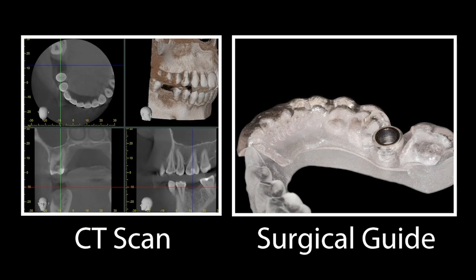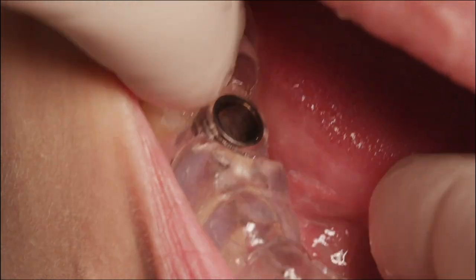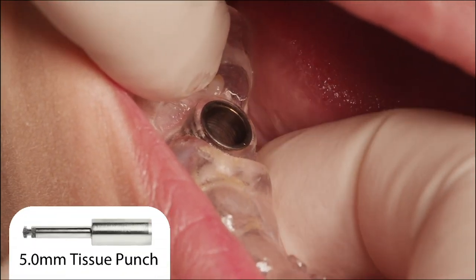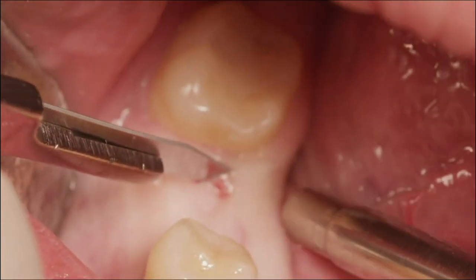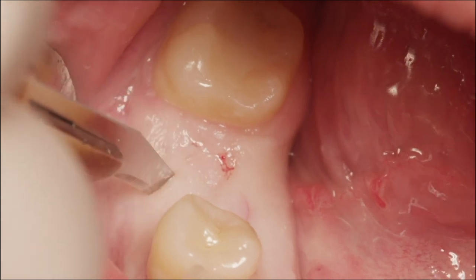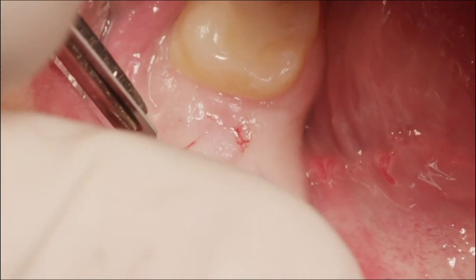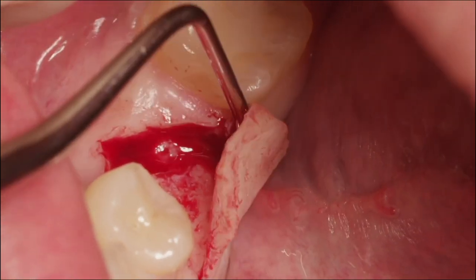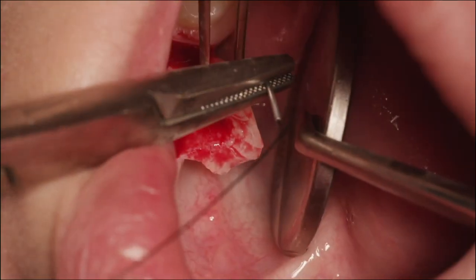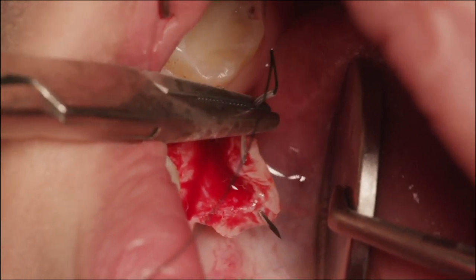After taking a CT scan and having a surgical guide fabricated, the guide is inserted into the patient's mouth to ensure its proper fit. The tissue punch may be used if a flap is not desired. Remove the guide and expose the crest using a conservative flap. A retraction suture is used to facilitate the proper seating of the guide and to keep the flap out of the surgical site.